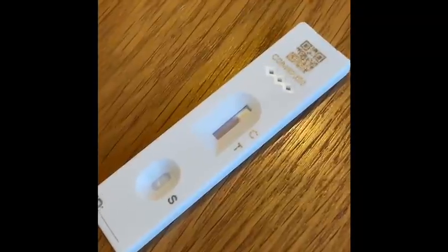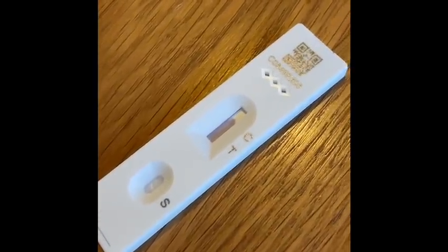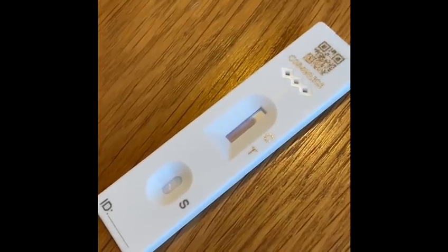The C means that is negative, C and T means that is positive, and T means that is invalid. Luckily mine is negative, but if you do get a positive one, do not worry — you just need to go and get a proper test at one of the test centres.